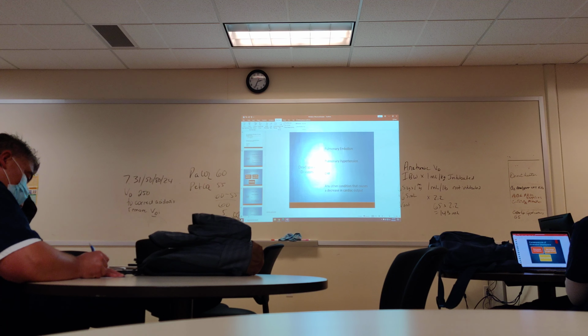So the second one, if I can't do this, I'm going to go up on the rate. Okay? Now, there is one more step to that. If they're both max, I'm going to go ahead and just keep going up on the rate because it's safer. You don't want to go up too high on your tidal volume because then it can start causing barotrauma and issues that I'm not trying to deal with. I'll just go up on the rate. So first, go up on tidal volume. Second, increase rate. If I'm maxed on both, go ahead and keep going with the rate because it is safer than taking up tidal volume. Okay, does that make sense?